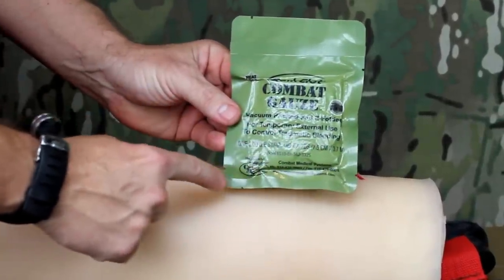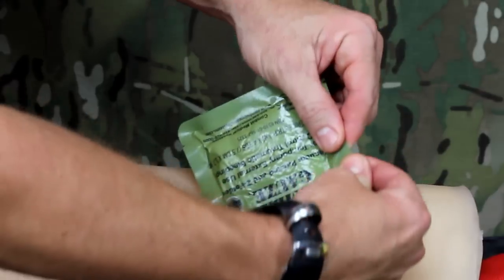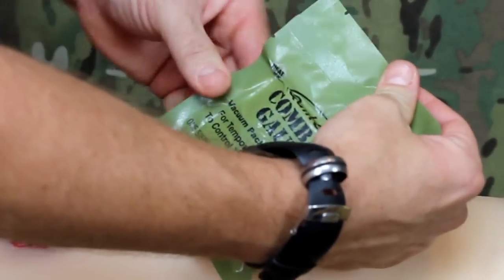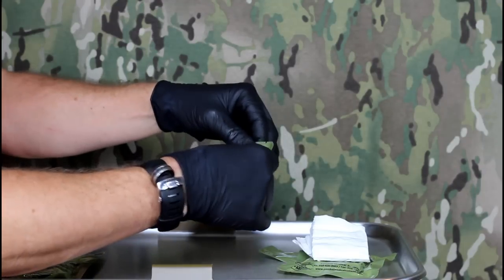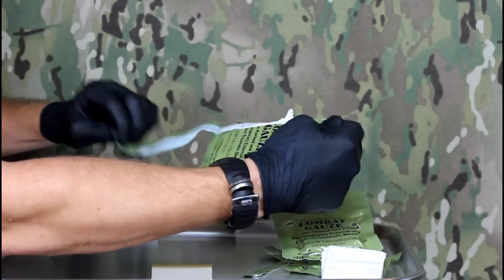There are six tear points located around the edge of the packaging. It is important to use these points when opening, as it is difficult or impossible to tear the package otherwise. Using the tear points, the package can be opened horizontally across the top or bottom of the package, as well as vertically along one side.